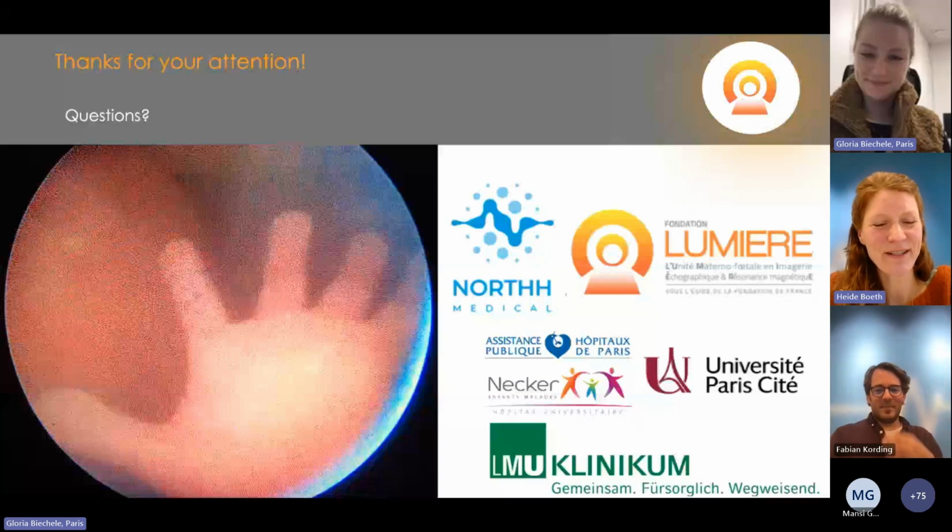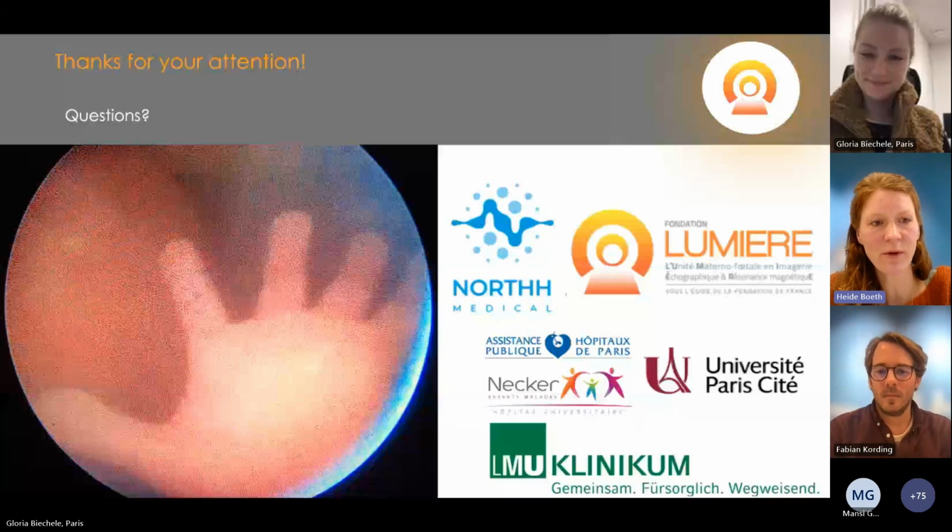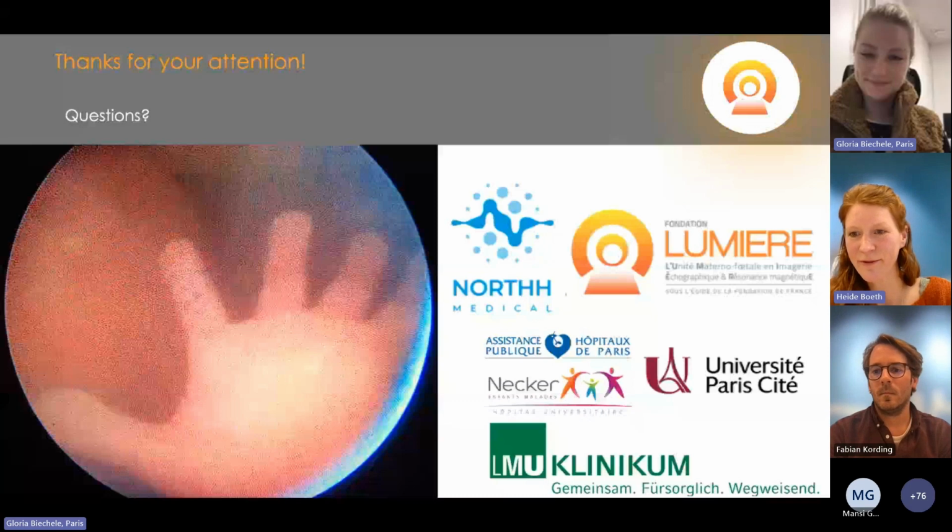Okay. And just a short addition, because you have shown images where you said it's not the best image quality, I would like to mention that that was also the idea behind this webinar session today. We don't want to show only the best images, like it's sometimes the case when you present in a webinar. We want to show today the reality, so also the challenges. So you see the real scan from the beginning to the end, including challenges. Thank you for making this point.